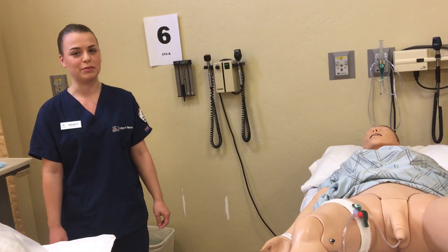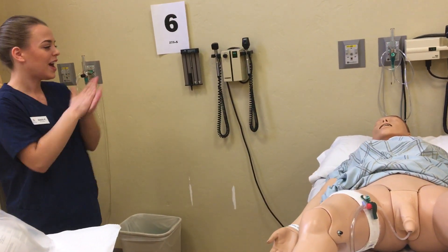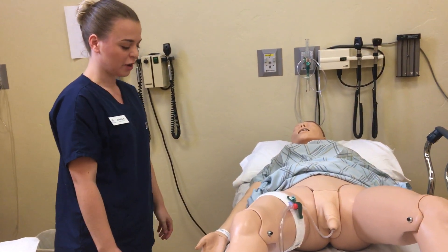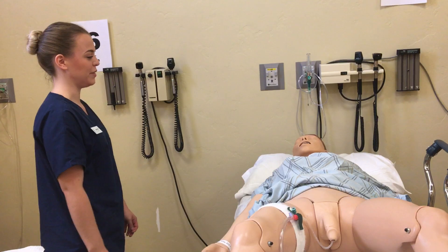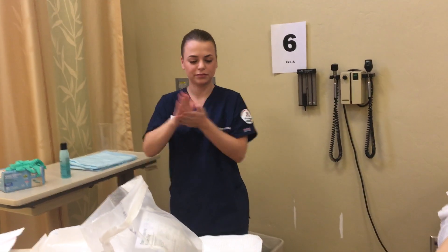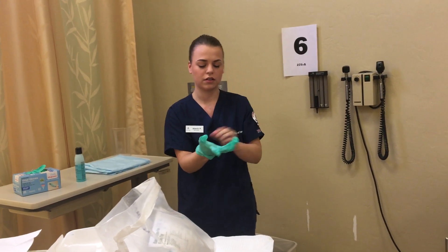I'm going to step out of simulation and pretend that it is three days later and I'm here to remove the patient's catheter. Hi, good afternoon. My name is Ally and I'm going to be your nurse again today. Can you please tell me your full name and date of birth? Nicole Blackburn, 2-10-1998. Good, that's what I see on your armband. I've checked your chart and your physician has put in an order for me to remove the Foley catheter we inserted a few days ago. Looking at the Foley catheter kit — it is a latex-free 14 French Foley catheter, it is not expired, the package is open for testing purposes, and there is no visible moisture on the package.